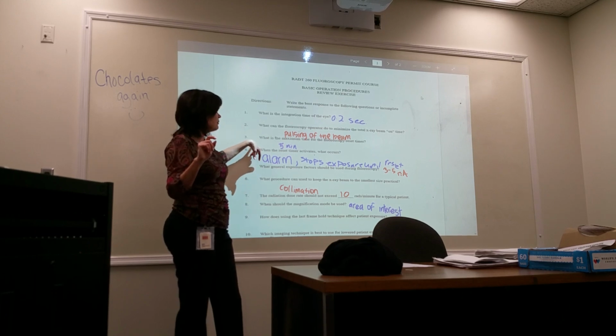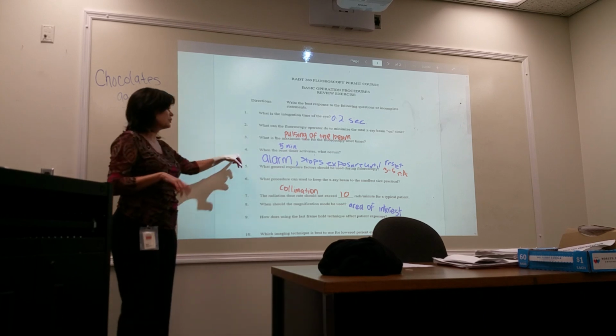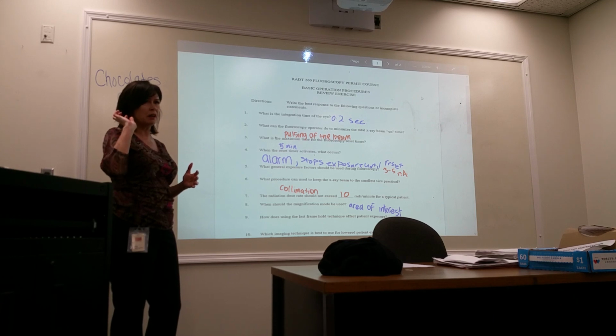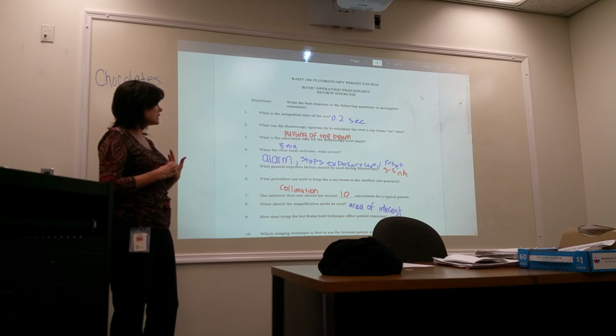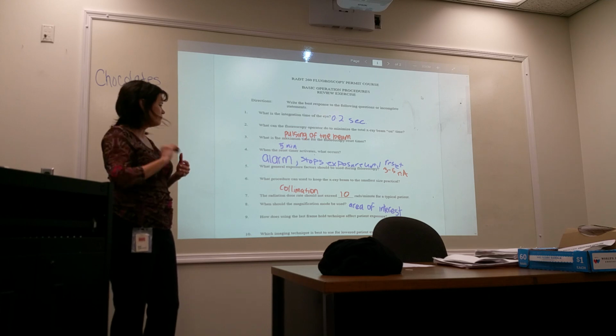What is the maximum time for the fluoroscopy reset timer? It is 5 minutes. What occurs is an audible sound, and there should be some interruption of seeing the image. So usually there's always a visual and an audible sound when making an exposure, or in this case, disruption of the exposure. What general exposure factors should be used during fluoroscopy? Fluoroscopy is usually 3 to 5 mA.